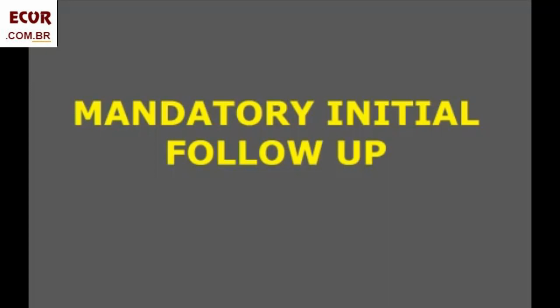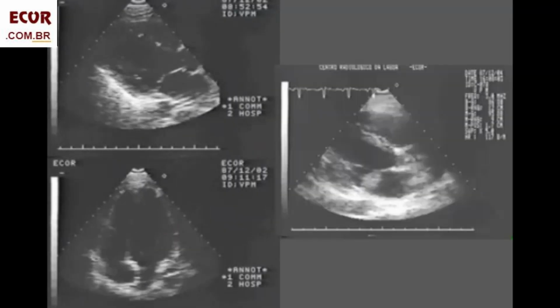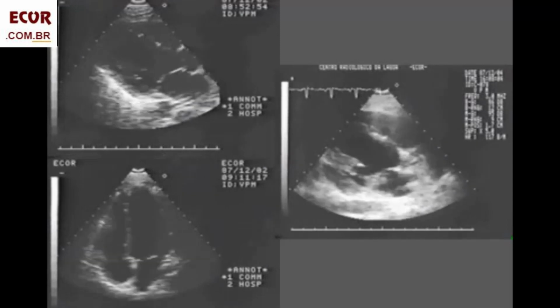The echo follow-up of a patient with endocarditis is mandatory. The vegetations may get larger during treatment, not because of worsening, but only due to deposition of platelets or fibrin. Then what we should be aware of is the clinical response to the treatment, not if the vegetation has enlarged. A progressive valvular destruction with worsening regurgitation is an indication of a persistent infection. An abscess may be developing during patient clinical improvement. This is an incredible case that shows how we should follow these patients.